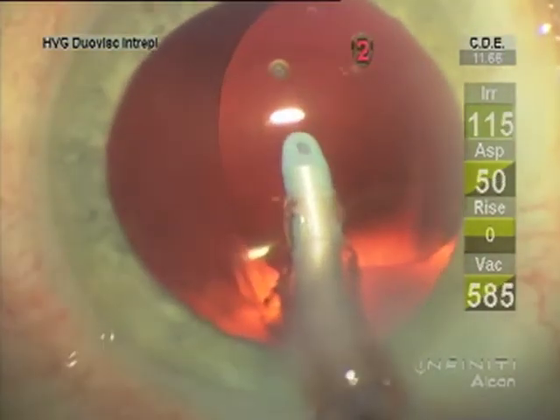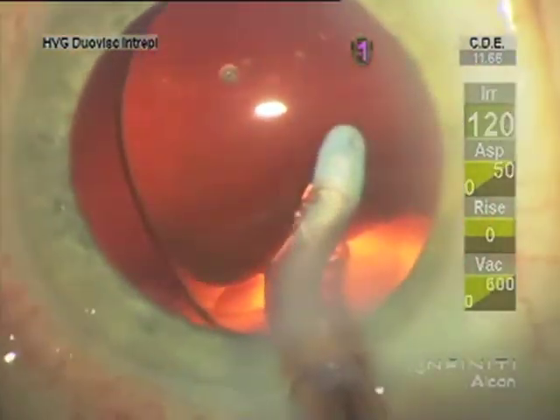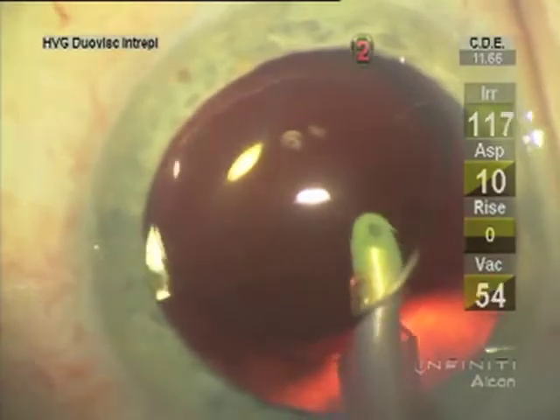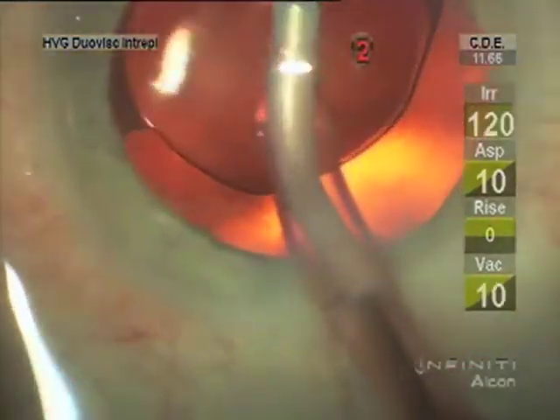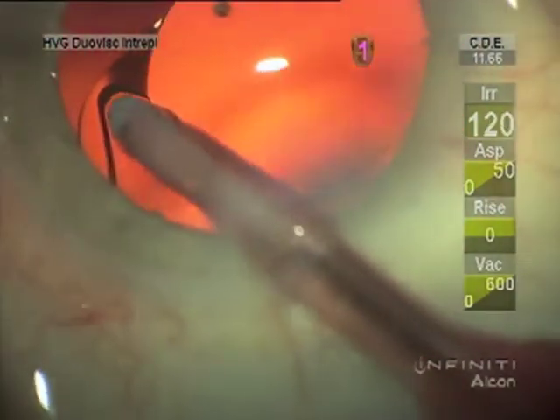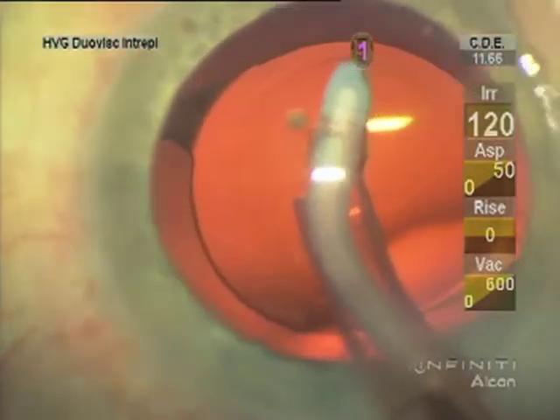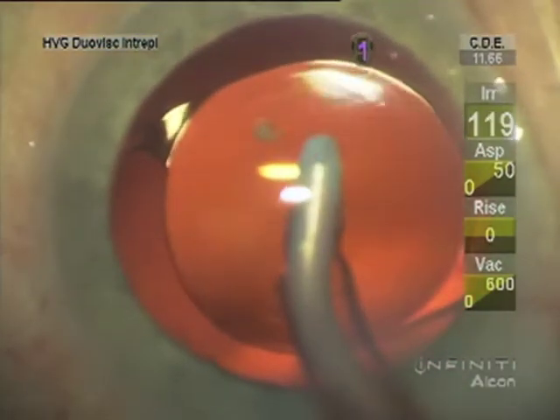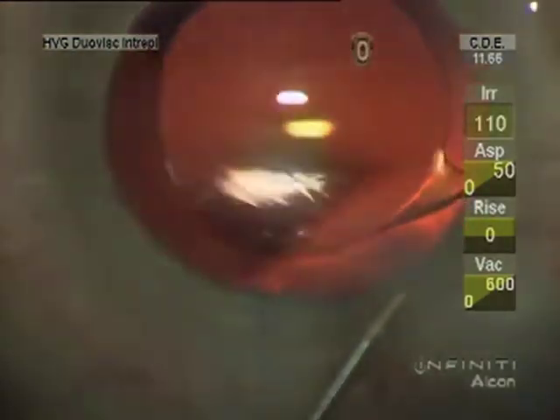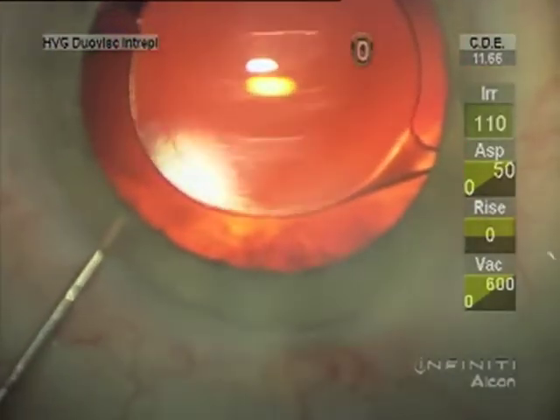Removing the cohesive viscoelastic, I use a very high vacuum for good followability and then slip under the lens to make sure there isn't any retained — but usually it pulls it all out with that very high vacuum evacuation. I turn the lens until the haptic-optic junctions are 90 degrees to my paracentesis site, then get under the lens with the vancomycin cannula after hydration of the wounds, making sure that we have a watertight situation.